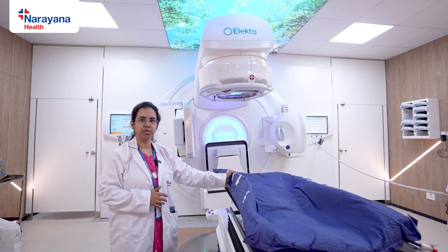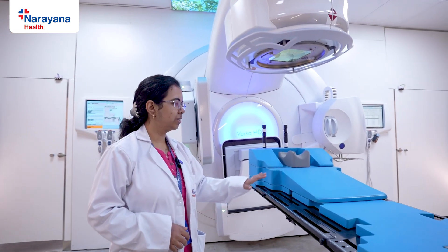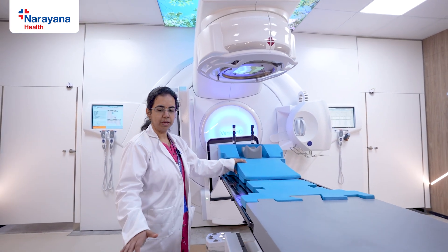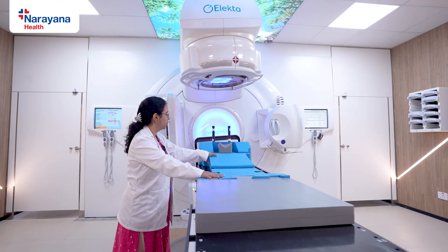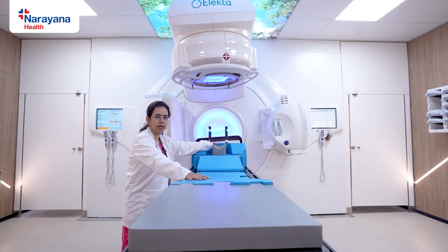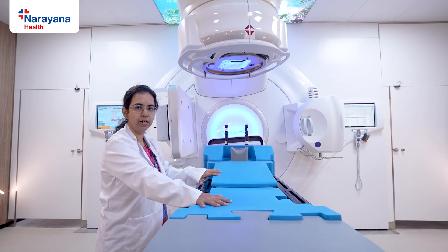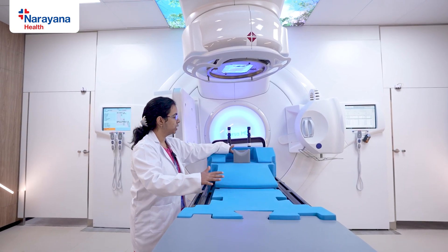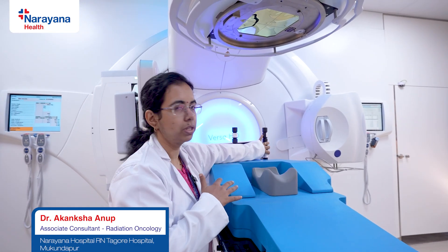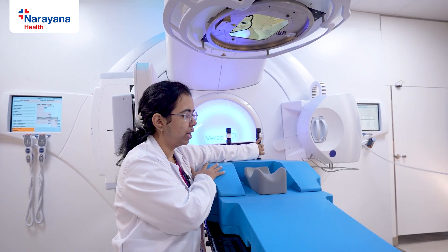This is another setup for breast patients, known as the breast board. The patient sits here, places her head in the headrest, and then lies down. This is a more tilted breast board used for certain indications and techniques. Once her head is placed, her breasts are exposed. She has to hold these rods with her hands, which are kept at the back of her head — right hand here and left hand here.